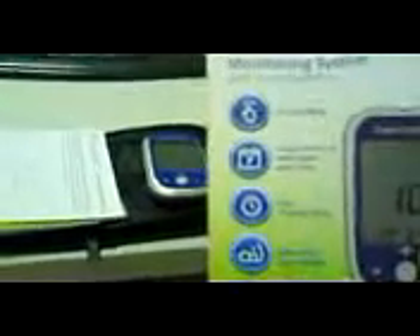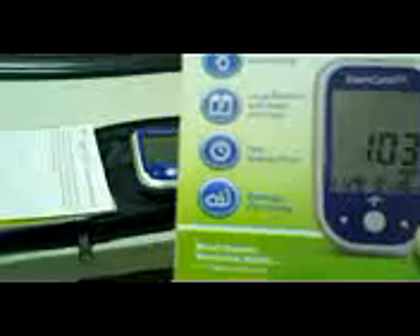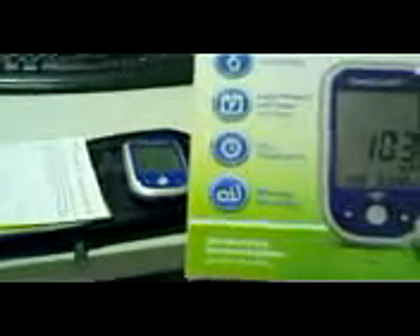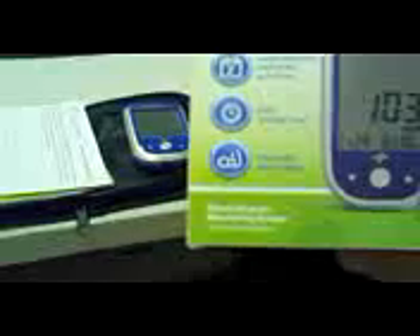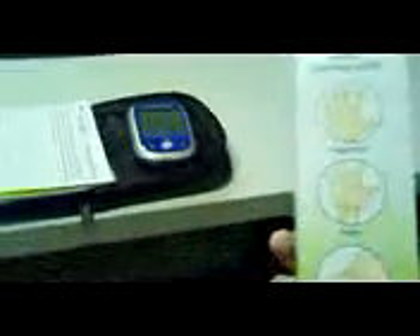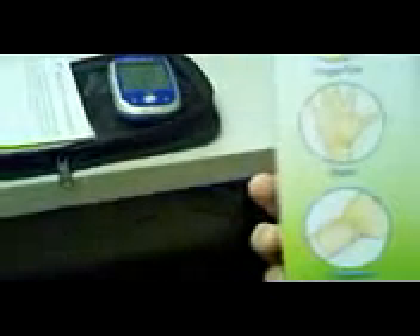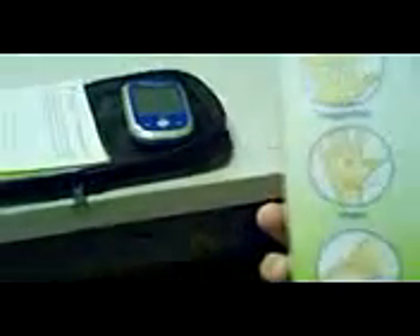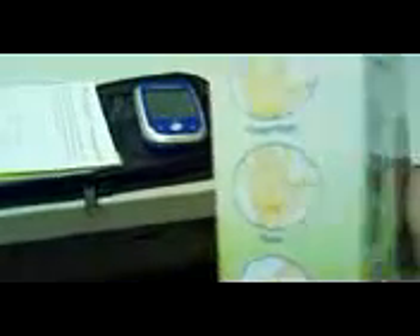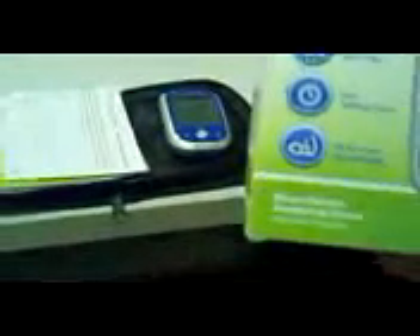As you can see, it does auto coding, it's got large memory with date and time stamp, and it'll save up to 300 memories. It also has a fast testing time. What's very critical — a lot of people call and ask us about — is the alternate site testing. It will test the fingertip, the palm, and the forearm, so you're not limited to one location. It also has voice guidance, so if you don't have very good hearing, this feature will help you out.